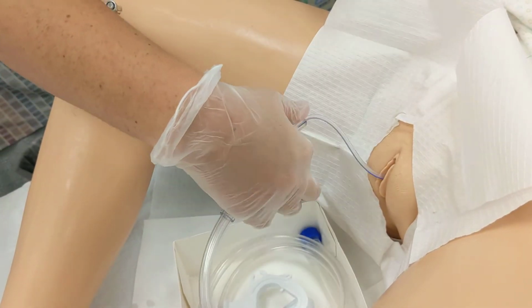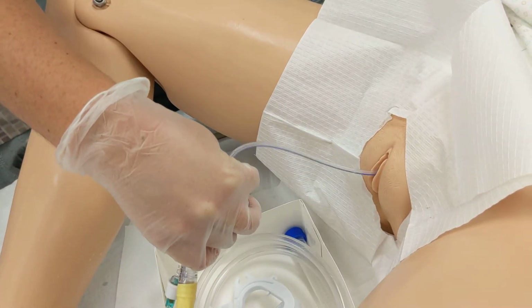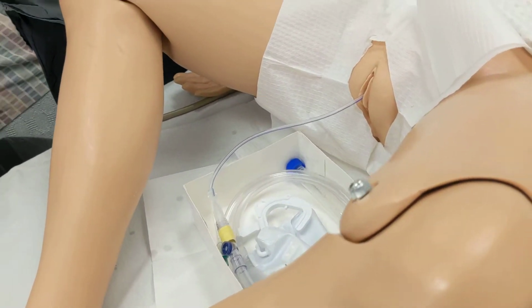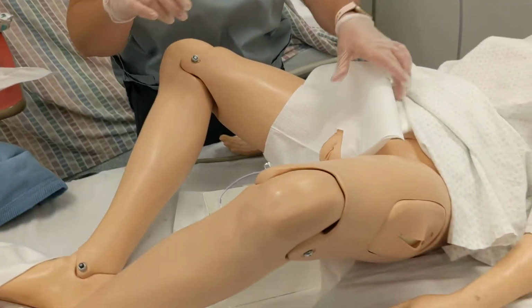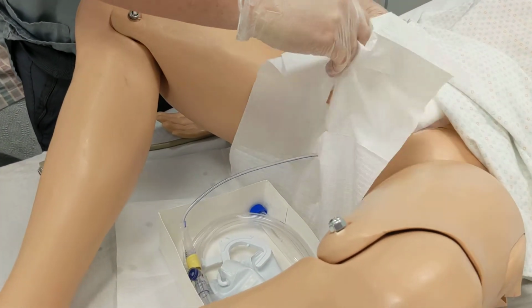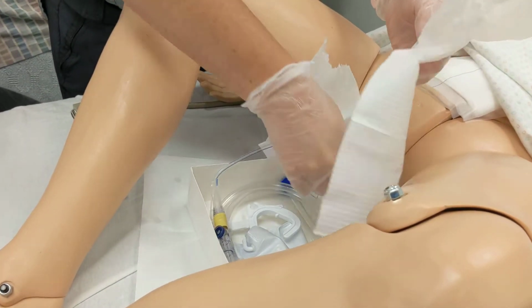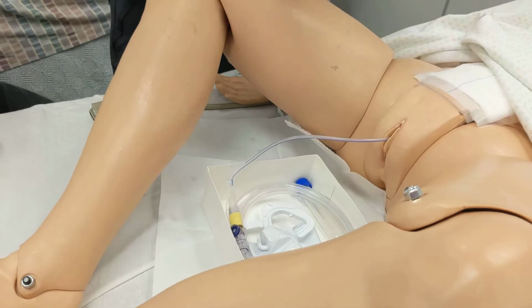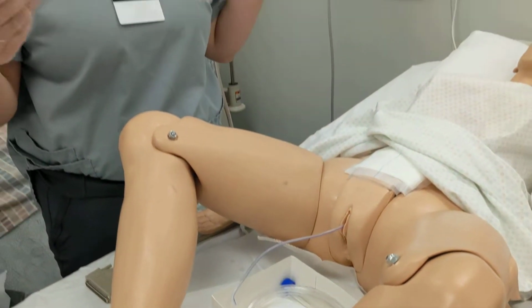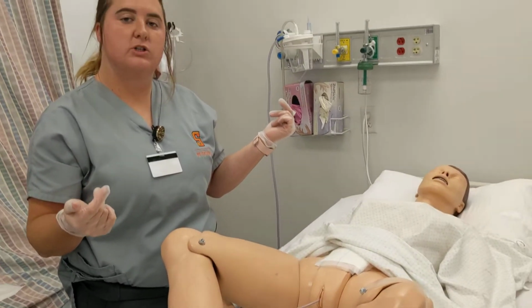I'm going to slightly pull. Oh, it's right there. So it is in correctly and good. So now the sterile procedure is finished. So I'm going to take this off. And also before this, I would ask the patient if they had any allergies to latex or to iodine, which they did not.